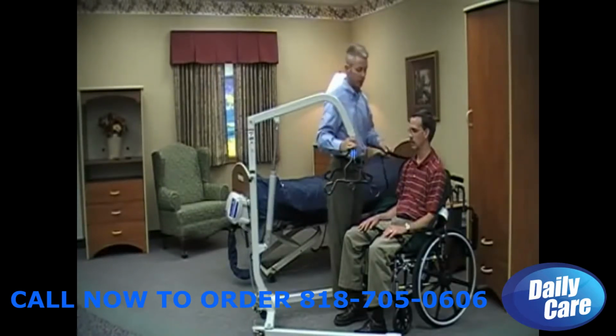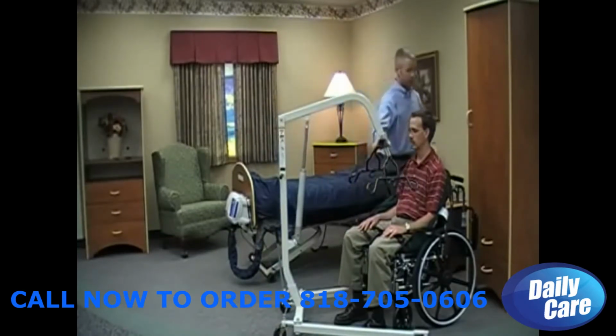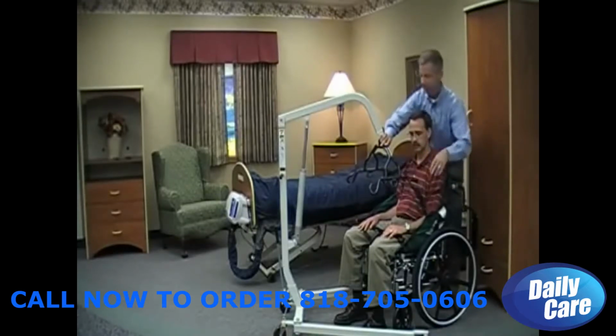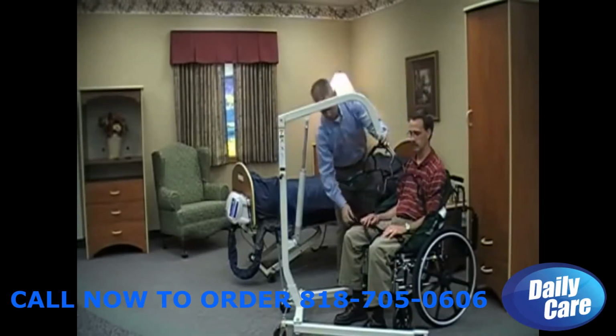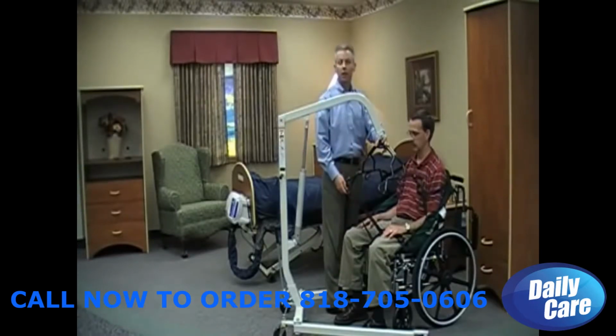So I'm going to use the longer straps on the shoulder and simply make that connection. And likewise on the other side. And after having done so, I'm going to proceed with my leg connections. And again, you've got different strap lengths, depending on how you want to position the resident. If you want them more reclined for transfer to a bed, you can use the longer straps. And if you want them more sitting for transfer to a chair, you can use the shorter straps, or in this instance with the legs, you can use the longer straps as well.